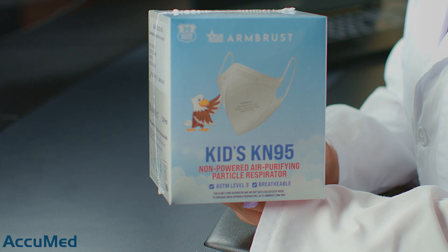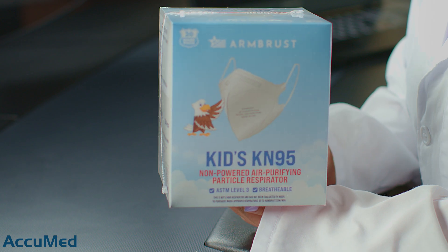Hello everyone and welcome back to the AccuMed channel. Today we're going to be reviewing the Armbrust Kids KN95 mask. We recently tested their Adults KN95 and unfortunately those did not meet the KN95 pressure drop requirements, so I'm very interested to see how these Kids masks test.